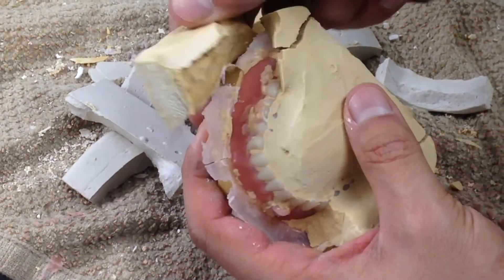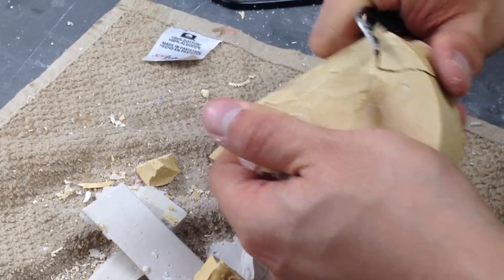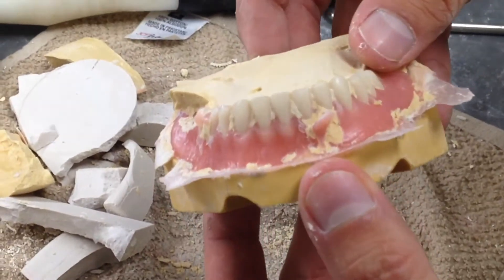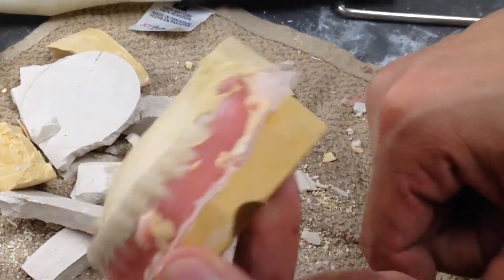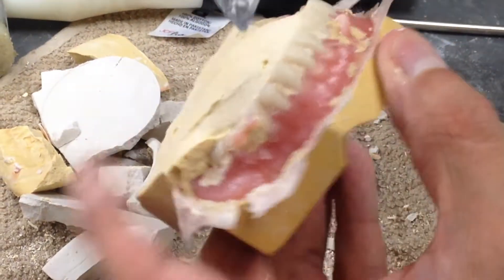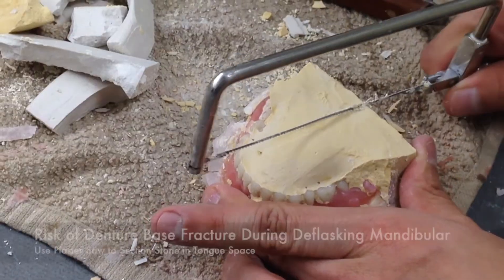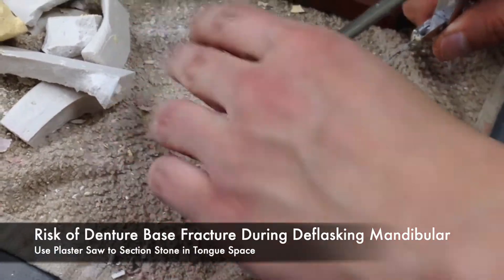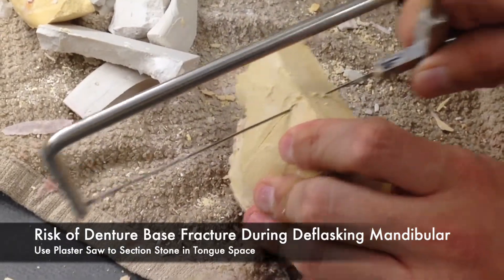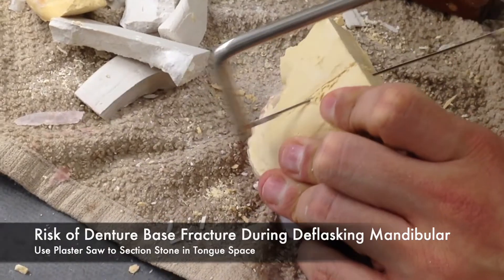Some of the more difficult anatomical structures to remove stone from during de-flasking are the maxillary palatal area and the lingual tongue space of the mandibular. In order to do this safely, using a plaster saw to saw the tongue space or maxillary palatal area in half can aid in relieving the stone from those areas without the possibility of fracturing the denture base or denture teeth.